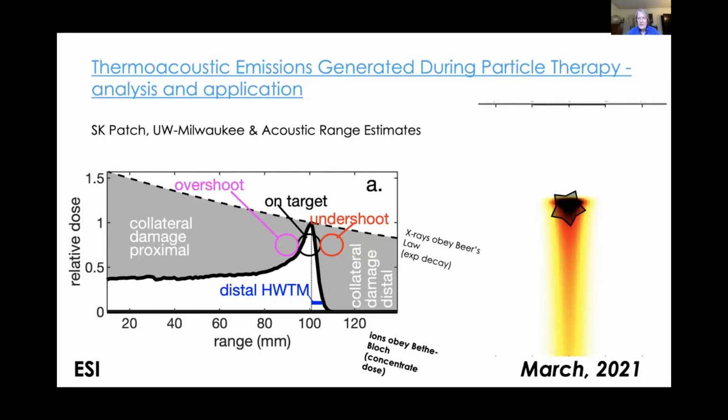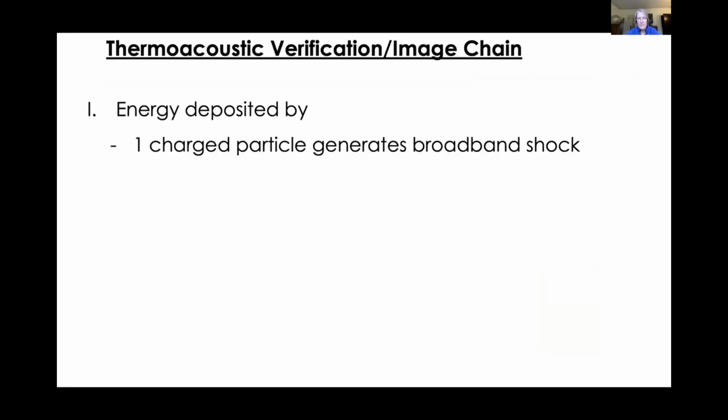And indeed, the point of radiation therapy is to damage the tumor. So if that tumor shrinks and some serous fluid develops around it, you can actually have a change in the range of the beam simply because the material that the beam interrogates has changed. So a soft tissue range verification technique that functions in real time or close to real time is critical to really make this technology applicable to many tumor sites. Currently, it's primarily used in the brain and for central nervous system applications.